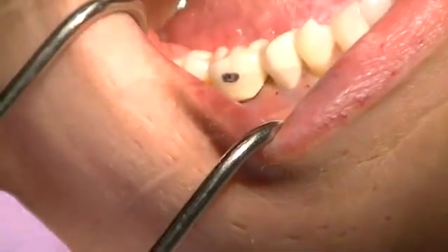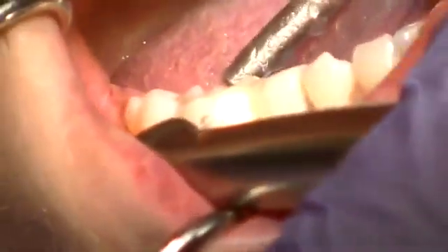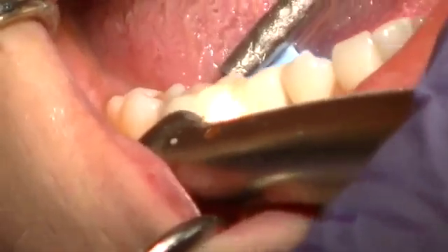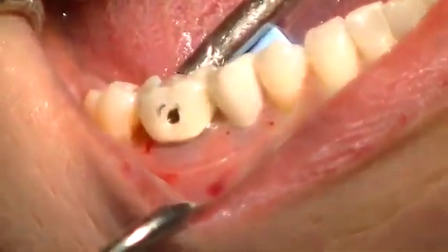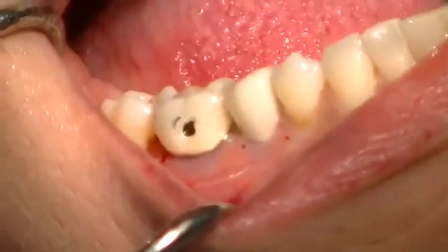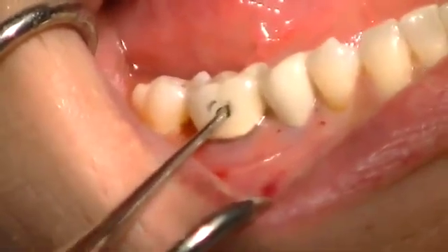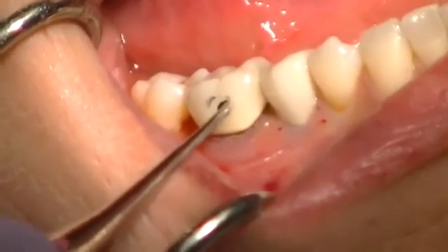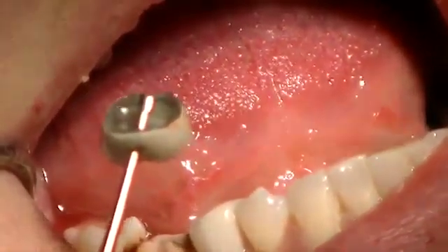I'm taking my high speed with a burr and making an elliptical opening through the porcelain, through the metal, onto the occlusal table — or where I perceive the occlusal table to be. We'll go all the way through, and you can see it's just a small opening. If we were just going to re-prepare this tooth, it would be quite easy to use this old crown as our temporary restoration and just cover that hole with a little composite material. I'm taking my Whamkey, placing it through the little hole onto the occlusal table, and then just rotating my wrist. Almost like magic, this crown pops right off. It's a very innovative, simple way to remove a crown in a variety of situations — a wonderful tool that you should look into.